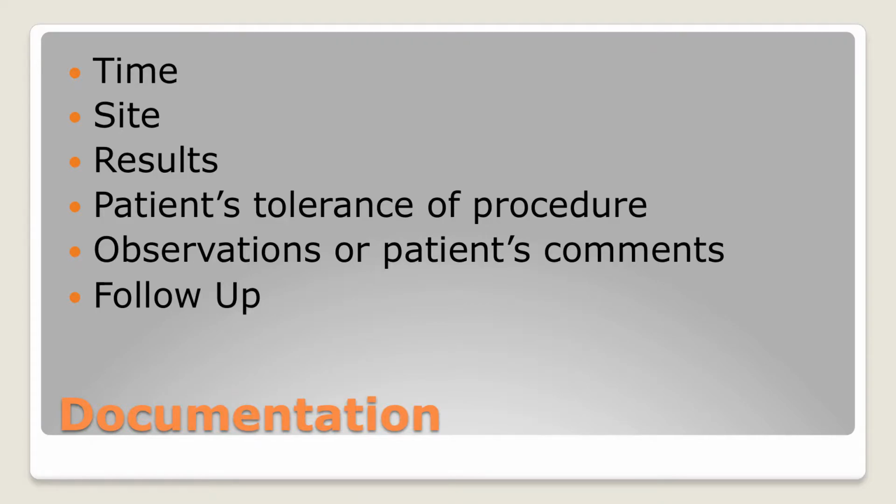If their blood glucose is outside of normal range, either too high or too low, what did you do about it? If you don't document it, you didn't do it. So make sure that you document what you did with your results.